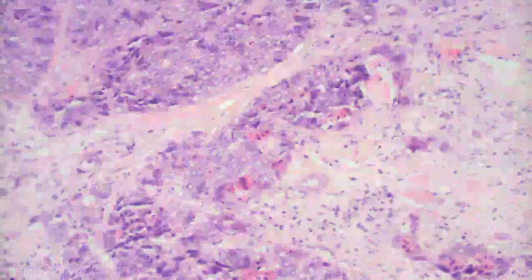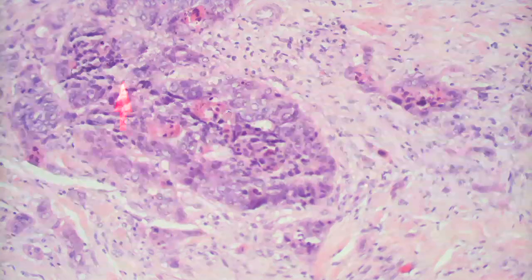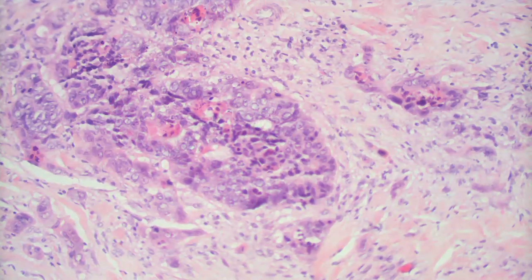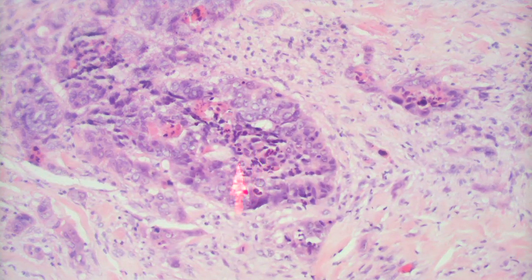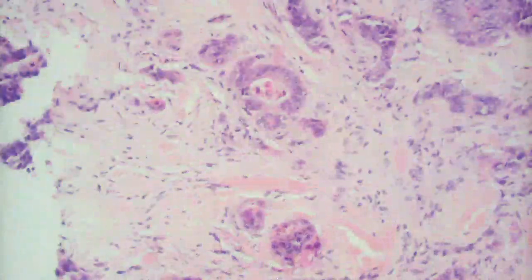source. Yeah. And you probably aren't going to be required to determine that, but this does have one characteristic feature that we see in this specific kind of metastatic lesion, this central necrosis. So-called dirty necrosis. You know where you see that? Is that ductal carcinoma? No, it's actually most common in colon cancer. Colon. So this is a metastatic colon cancer.